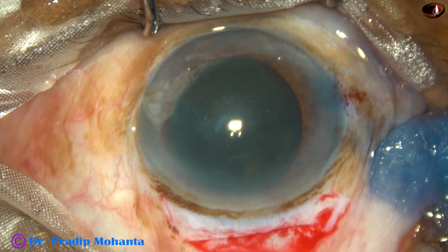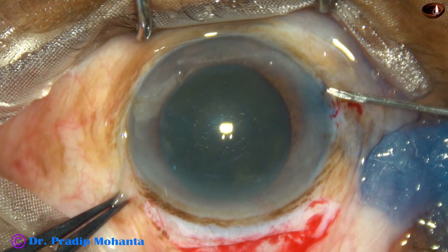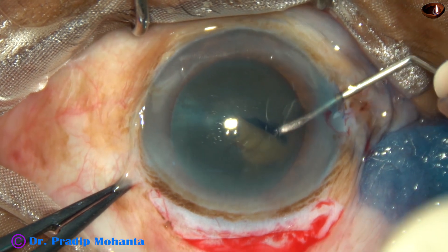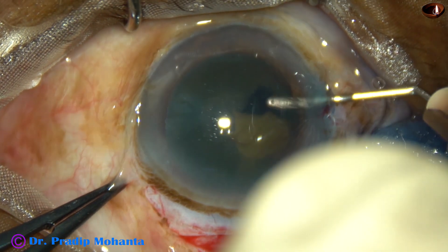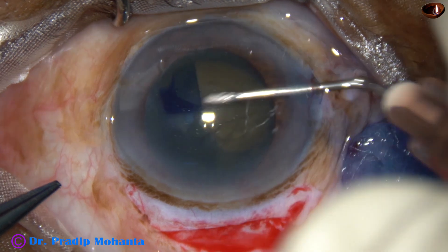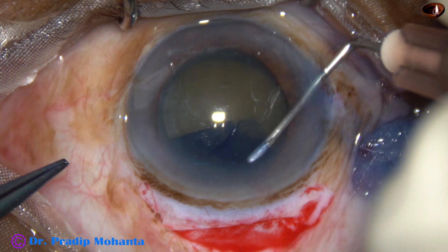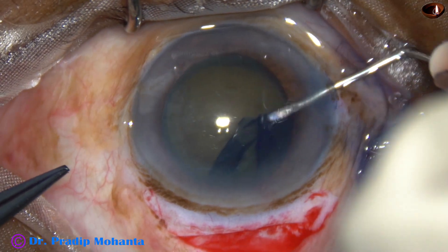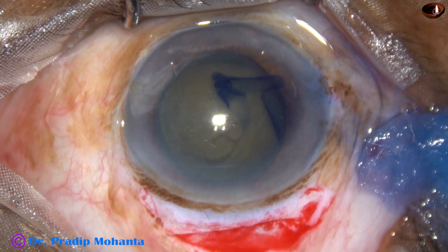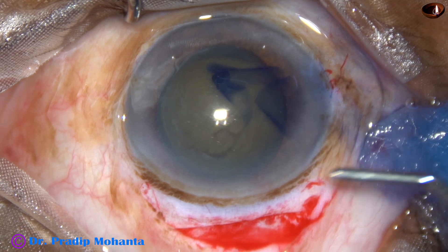Now, rhexis is being done in this case with the needle itself. Incise the capsule, raise a flap, flip the flap, and then guide the flap all around. Since the cataract is quite hard, I am doing a large rhexis, going almost along the margin of the pupil, and an adequate-sized rhexis has been performed.